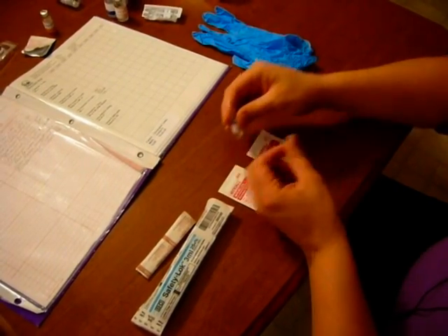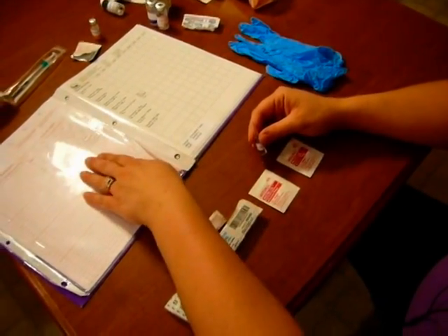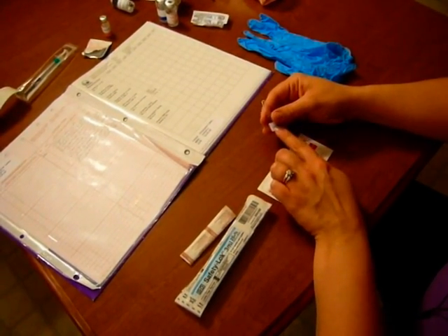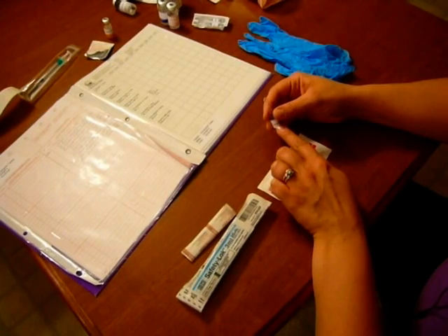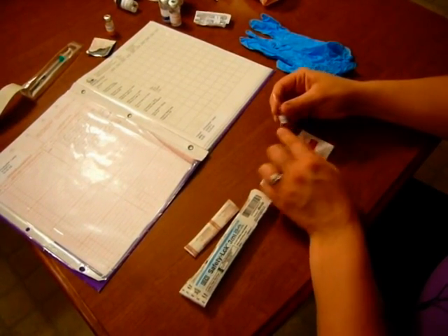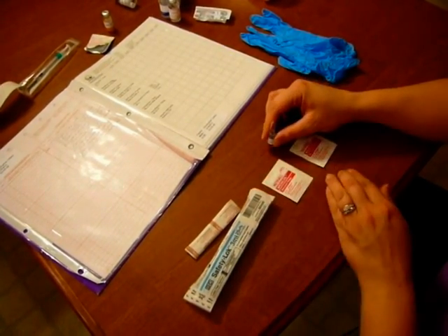Once all the medication is down at the bottom, we're going to do the same things we did for everything else. We're going to check our physician's order to the MAR, to the medication, to see how much we need to draw up. In this case, we're going to use DDAVP. We need two micrograms. This is four micrograms per mL, so we're going to be drawing up one half of one mL for the dose that we need.